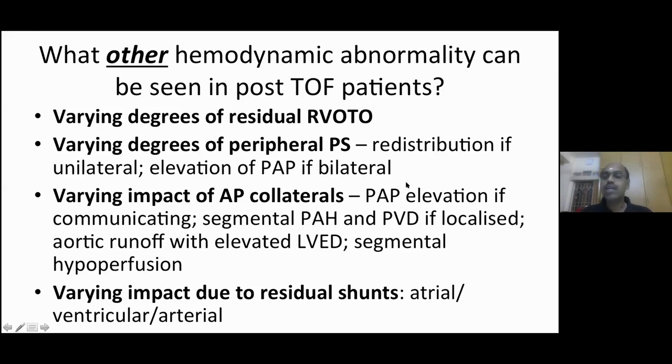In unilateral peripheral, I'm going to the question box. In unilateral peripheral pulmonary artery stenosis, how to assess the significance of gradients across the stenotic segment? In unilateral peripheral pulmonary artery stenosis, gradient is not given significance for assessing the severity of stenosis.